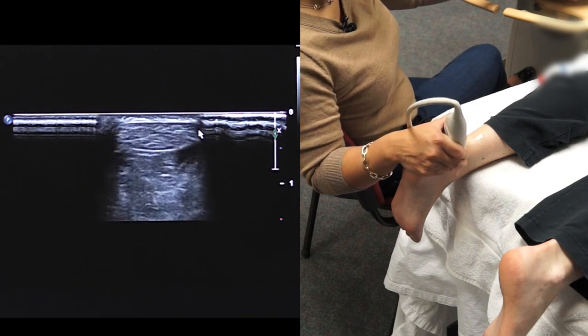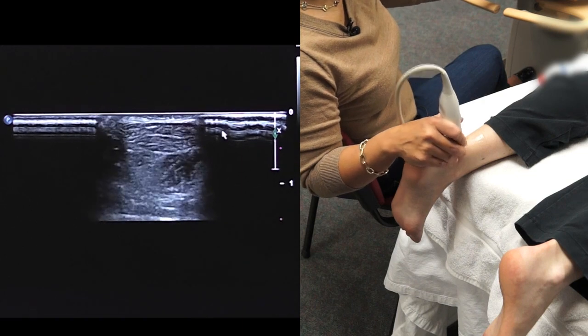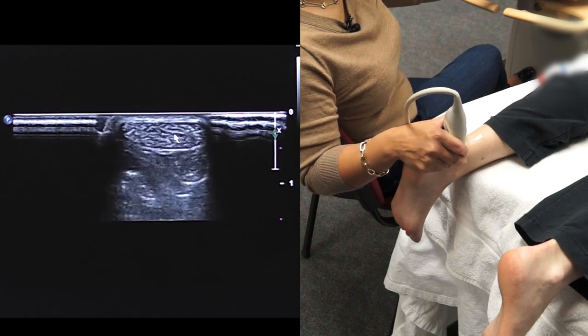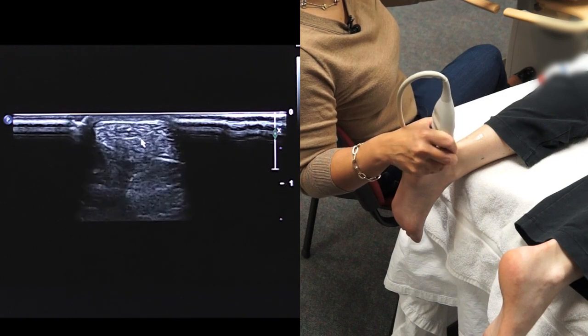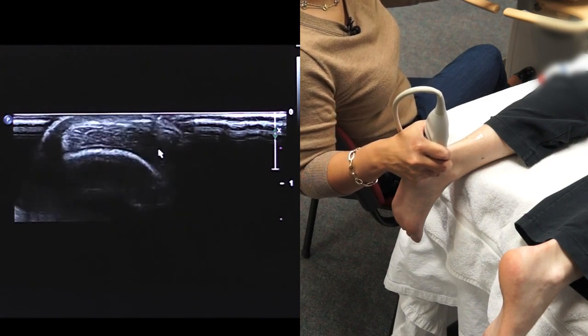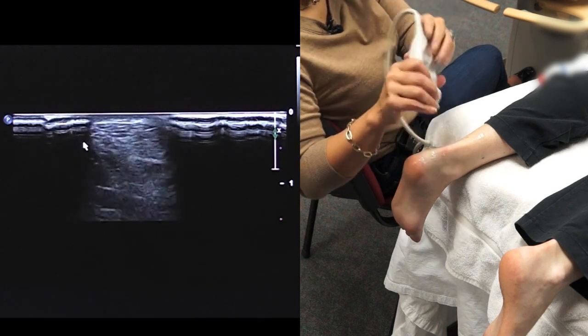Now, because we are looking at a very small surface, you tend to get dropout because there's nothing up against the transducer from lateral to medial. But you want to maintain contact with that tendon as you scan towards its insertion onto the calcaneus. Okay?